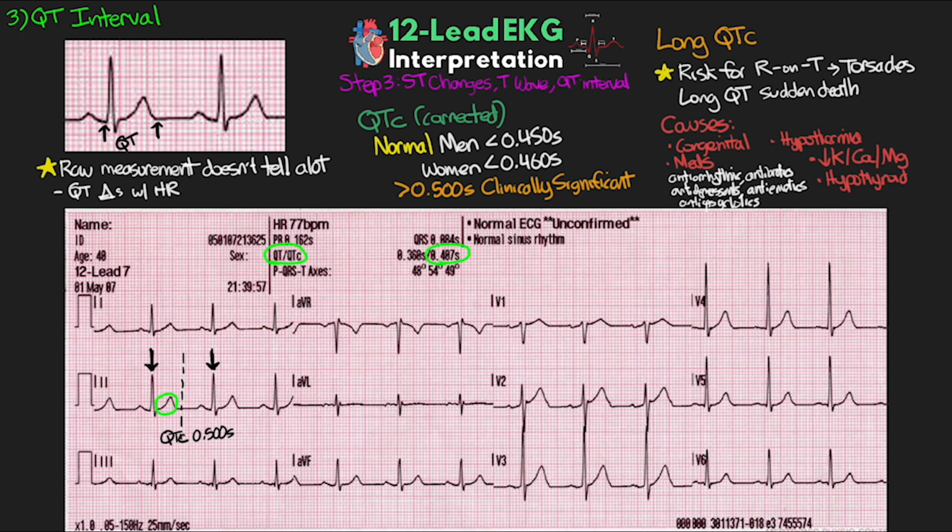So I really hope this was good information for you guys. Make sure and stay tuned for those future lessons where I'm going to dive even deeper into these different topics. So hopefully by the end of this entire series, you guys should be pretty comfortable when it comes to looking at and evaluating your patient's 12-lead EKG that you get in the ICU. So again, my goal isn't to make you as competent as a cardiologist. That's certainly not expected nor even needed. But it is important that you're able to look at this and quickly see some things, confirm with what the EKG is telling us as well, and be able to get people's attention to that quickly when needed.